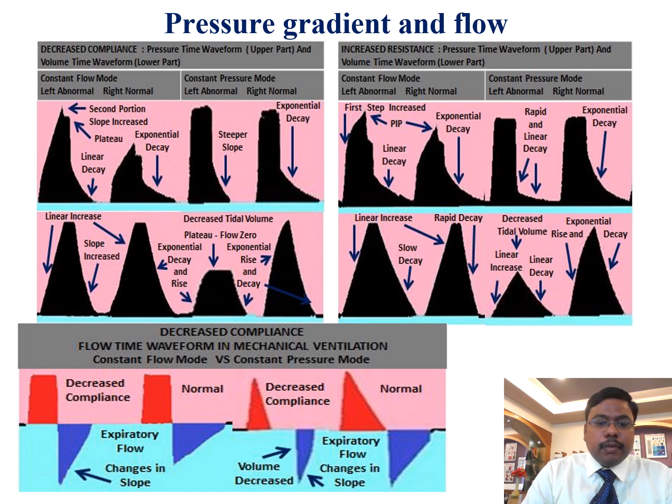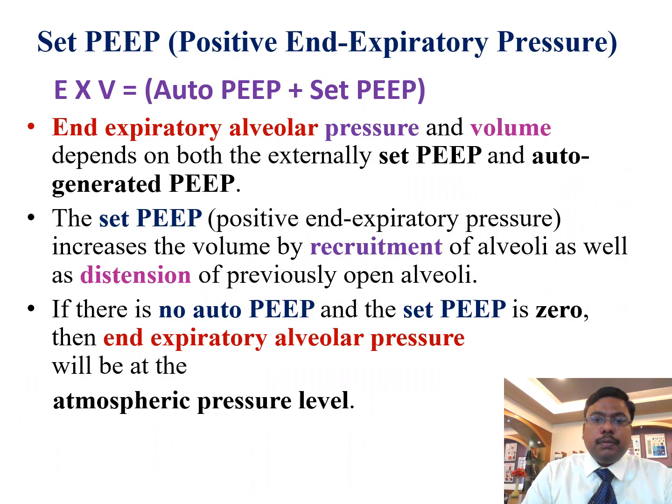And then in the flow time waveform also, for the decreased compliance, it is clearly shown the slope will change. And then the flow also will decrease if the compliance is decreased, and in turn the tidal volume will decrease, because tidal volume depends on the flow.